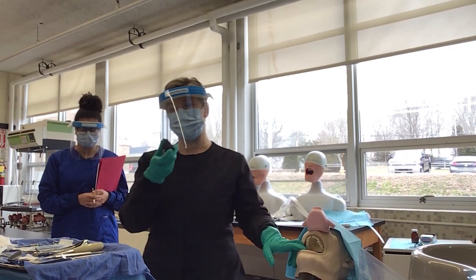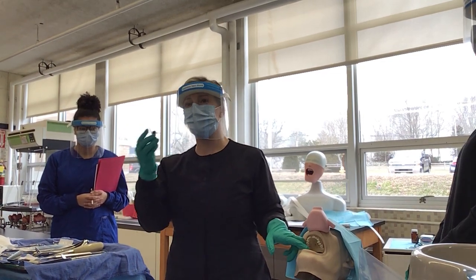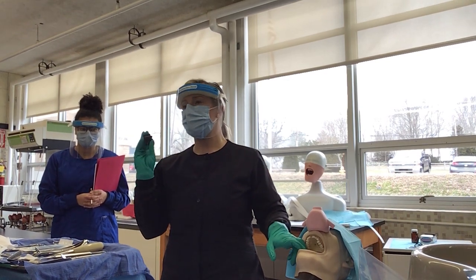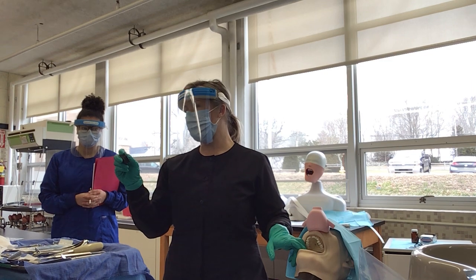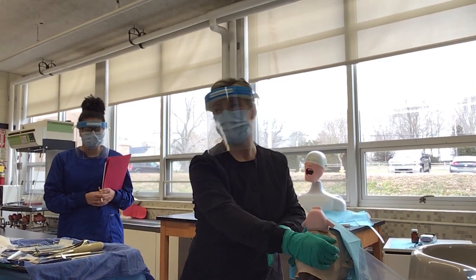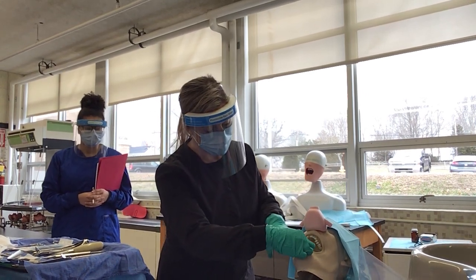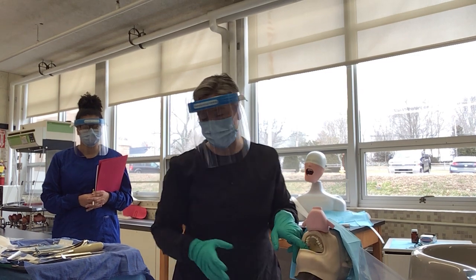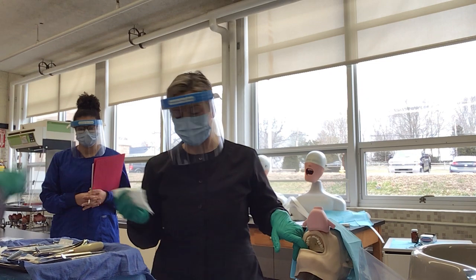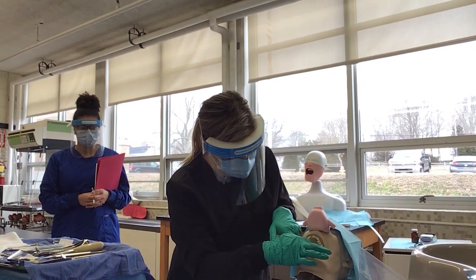You learned about this yesterday in EFDA labs, called a mouth prop. They come in child size, small adult, large adult. The side with the writing is going to go on the cheek, the narrower end is going to go further in the mouth, and the wider part to the buccal. If we're going to work on the left, that means I'm going to put the bite block on the right. Okay, and then I'm going to ask for a throat pack, please. Thank you. I'm going to put that in so that if anything comes loose, the patient is not going to swallow it.